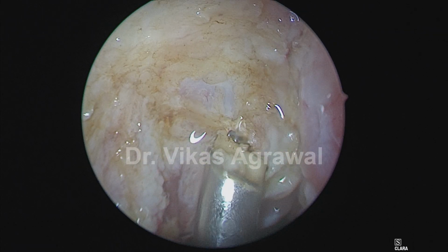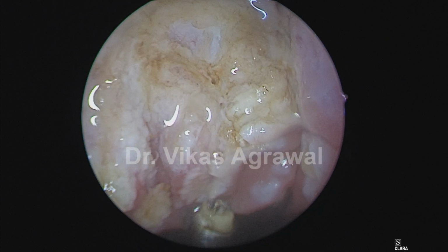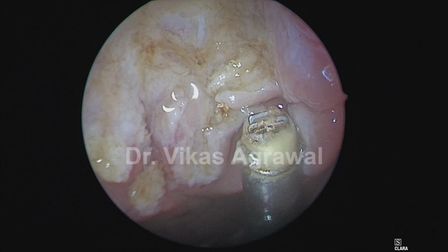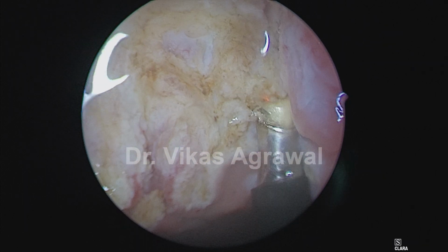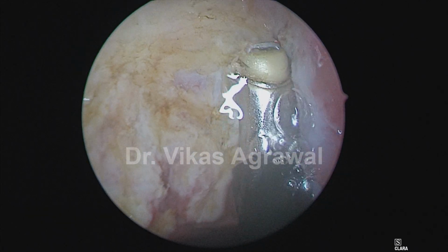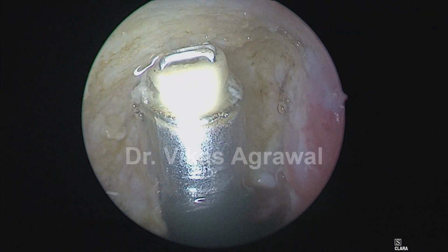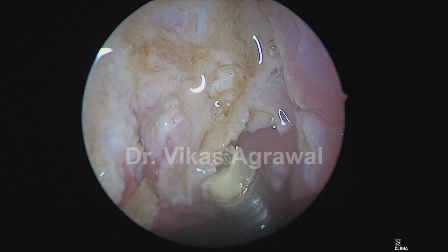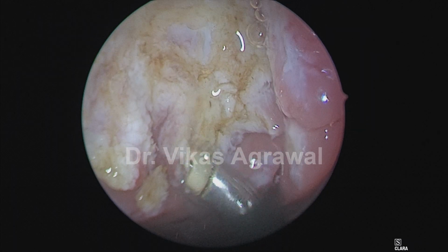So that is the fascia being defined. That is the posterior limit of the adenoids. And let me first define the posterior limit properly.